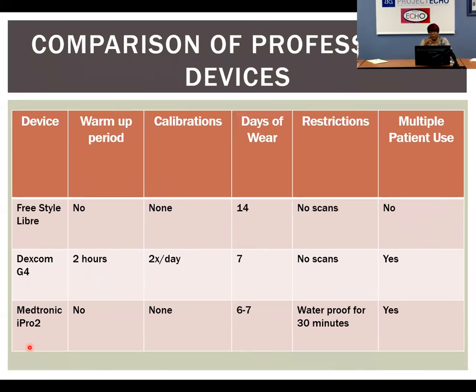And then the other piece that's a little bit difficult, when you go to sit down the transmitter into that base, you really do have to apply quite a bit of pressure. And sometimes that feels like, this may not be going very well, but it does take quite a bit of pressure and there must be the 2 clicks. Because if the transmitter is not seated properly, you will not get communication with your receiver. So it has to be fully seated or it will not respond.